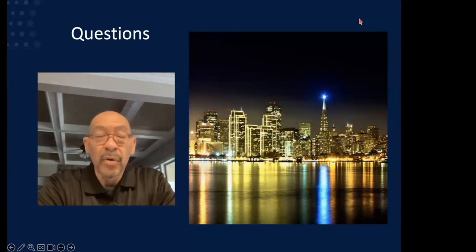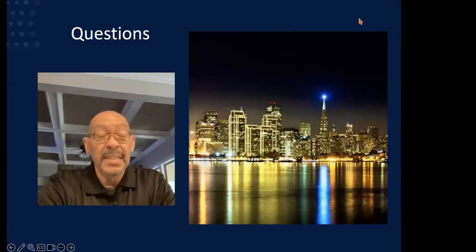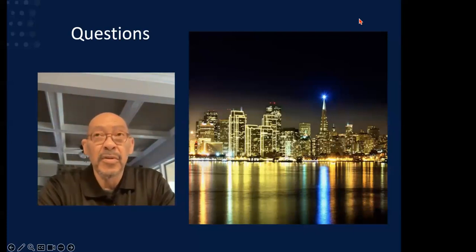This is a question I actually love, because the ICLs operate in a different part of the eye. So you can get an ICL today, you'll still need a cataract lens as you get older, because an ICL does not fix the part of the eye that is broken. So what an ICL does is very similar to what lasers do. It gives you a better optical outcome.